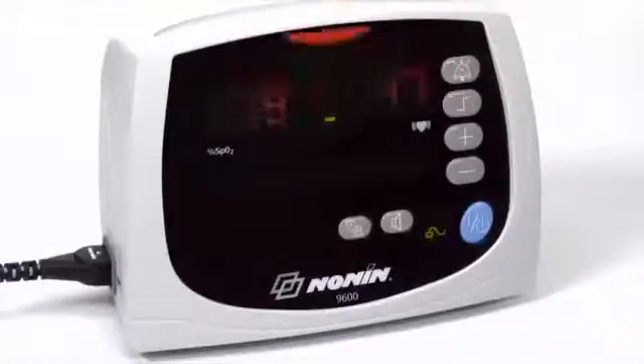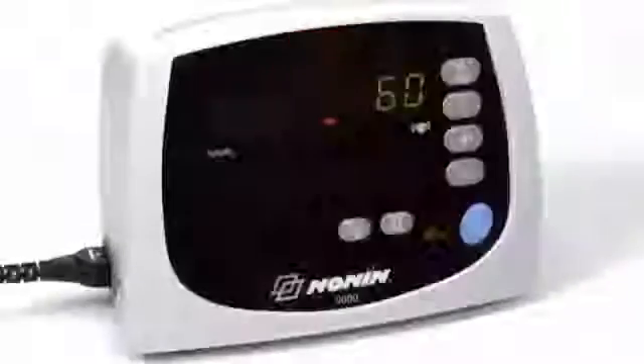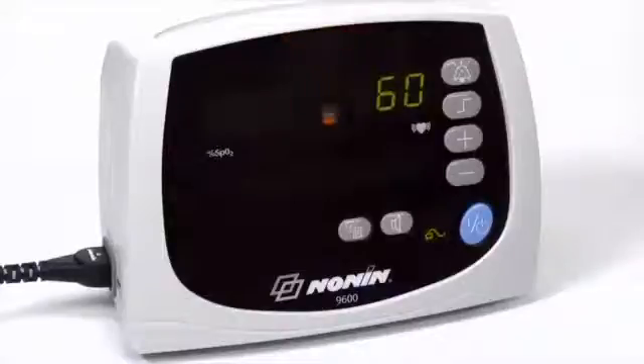When the alarms are in the unlocked setting, the alarm will stop and return to normal monitoring function when oxygen saturation level or pulse rate return to the preset range. This option is controlled by DIP switch 3. In the locked alarm position, you must press the alarm silence button to clear the alarm status.